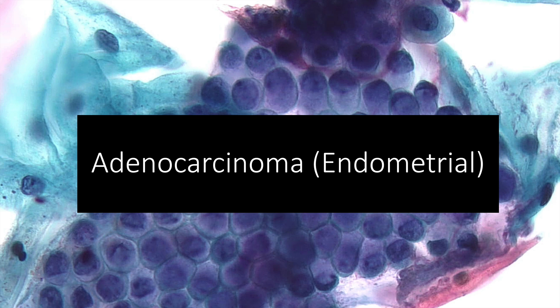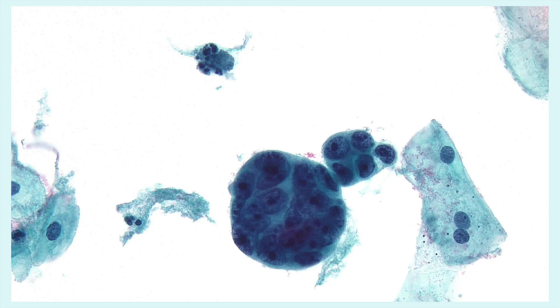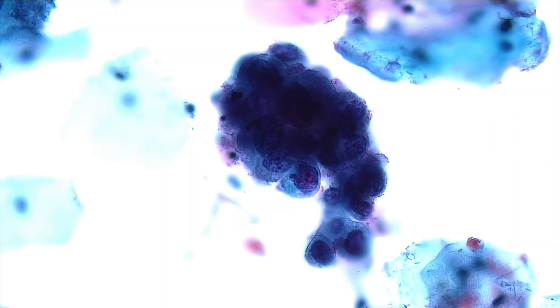Now we'll cover adenocarcinoma of endometrial type. This case was confirmed as endometrial adenocarcinoma on biopsy — note the tightly clustered atypical glandular cells with focal cytoplasmic vacuoles. Another case was a FIGO grade 2 endometrial adenocarcinoma, showing increased nuclear atypia and macronucleoli. A further case of uterine serous carcinoma showed increased nuclear-to-cytoplasmic ratios and macronucleoli — when you see macronucleoli, uterine serous carcinoma should cross your mind.